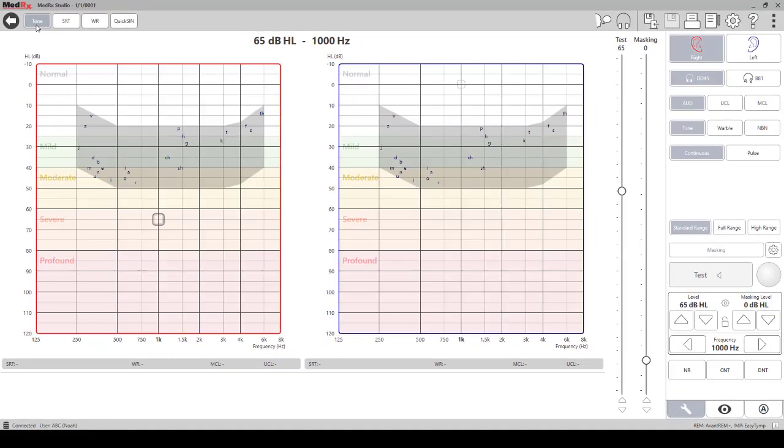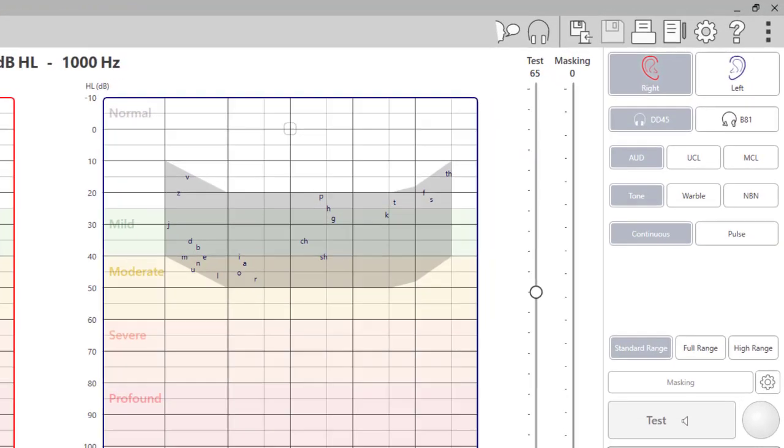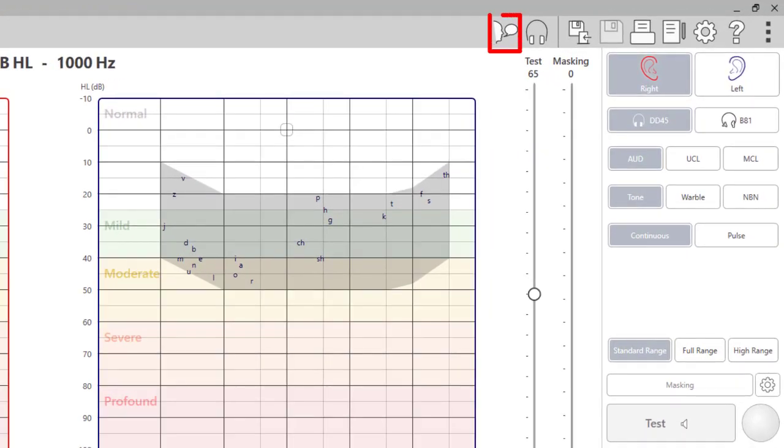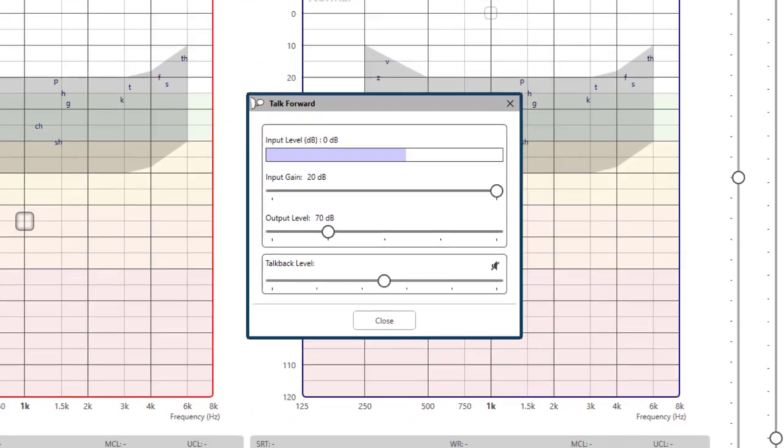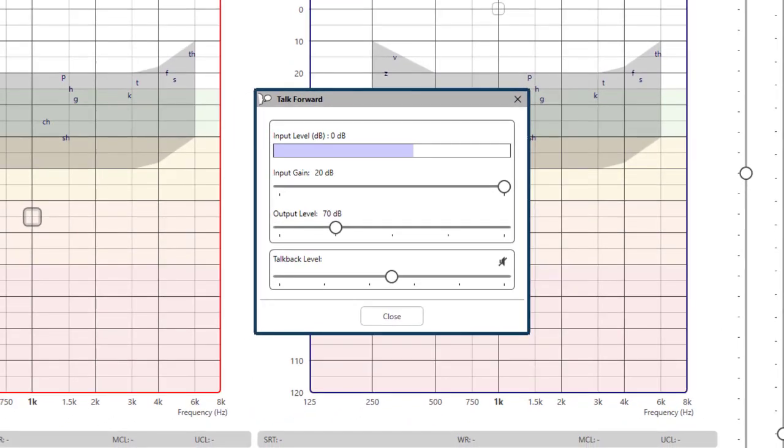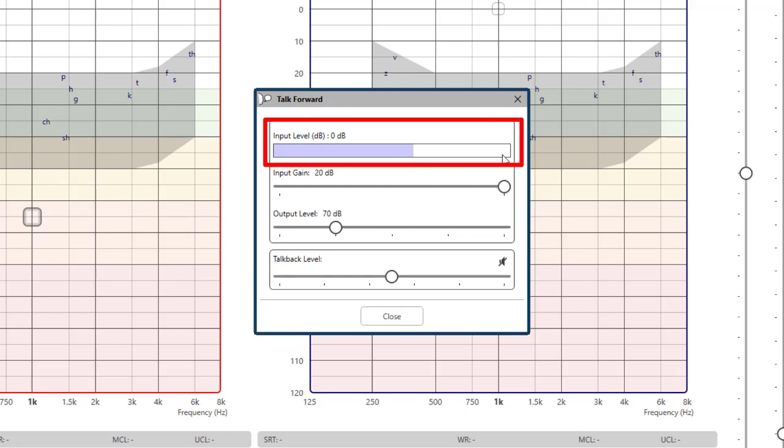In the top right corner, you will find the talk forward icon for instructing the patient. The input level controls the intensity of your voice through the transducers and to the patient. You can slide the VU meter to adjust.